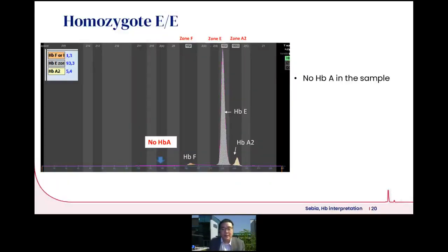In the instance of homozygous hemoglobin E, once again, you do not have the hemoglobin A fraction. And of course, the hemoglobin A2 is further increased in this instance.